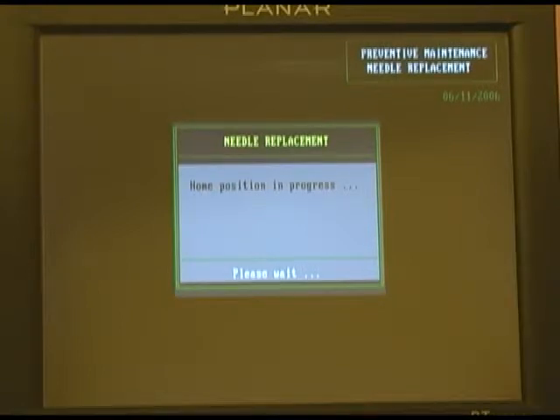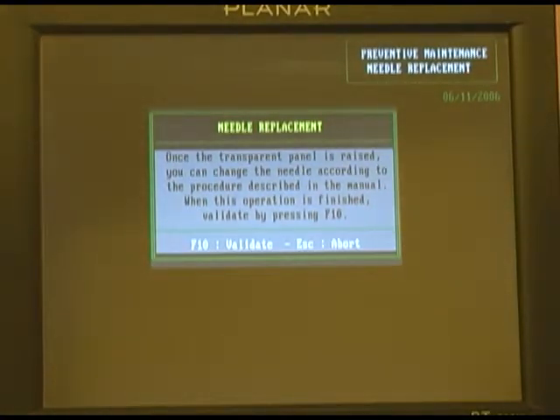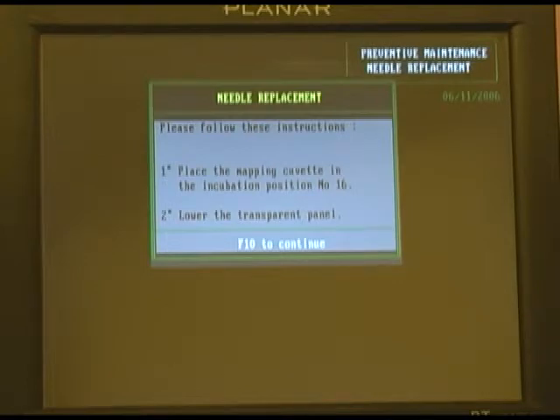The instrument will then home itself. Next, to make the needle replacement easier, it's going to open the drawer to give you additional access. It's going to move the needle forward, and it's going to ask you to raise the panel. It's going to give you 20 seconds to reach in and physically touch the tip of the needle to verify that your level detection is actively working. It's going to then ask you to place your mapping cuvette onto the measure block into well position 16. Counting from the back, that's the 16th well. Then lower the transparent panel and then hit F10 to indicate you've completed these steps.